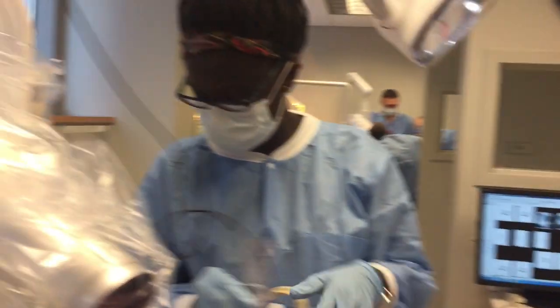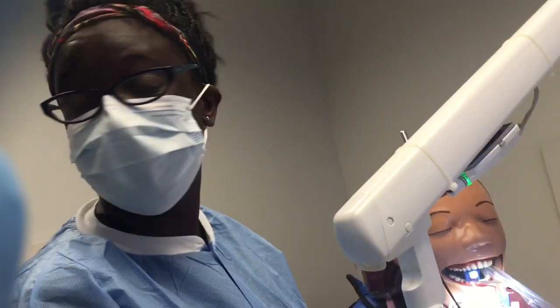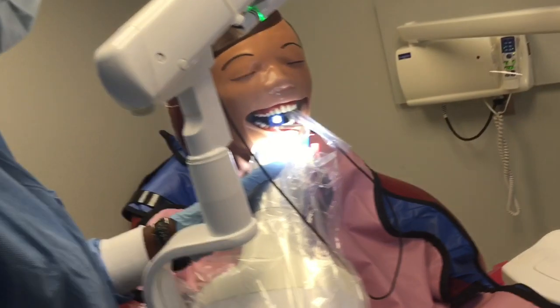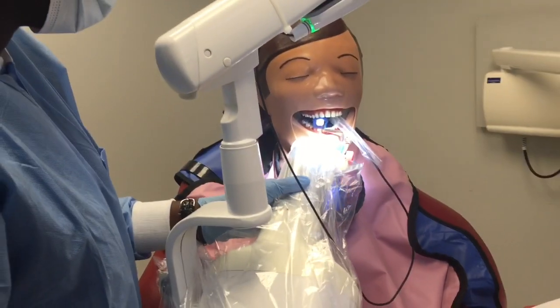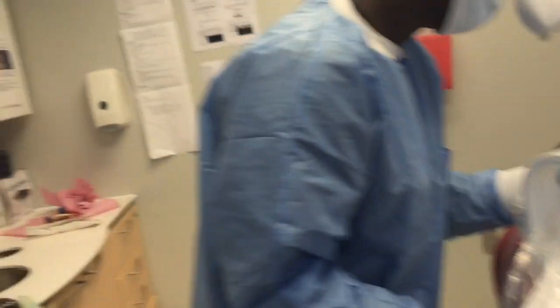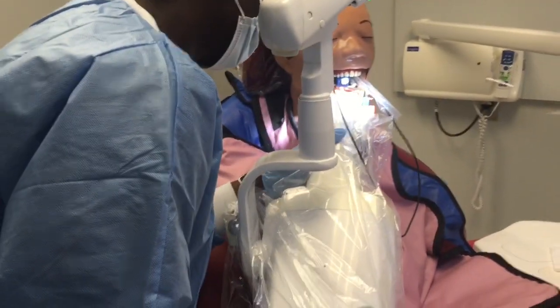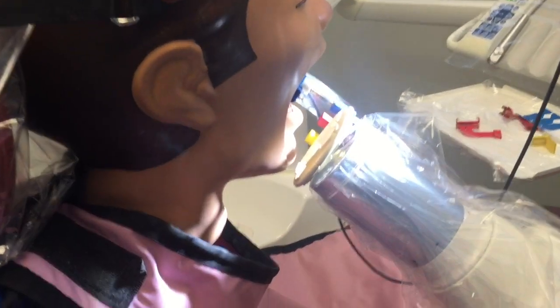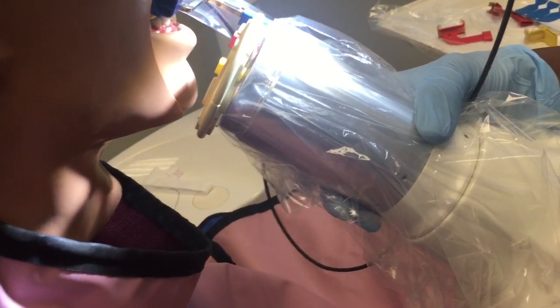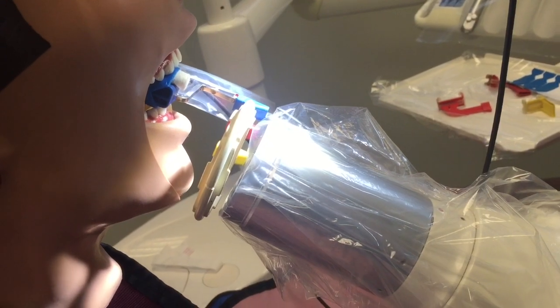We're going to take a radiograph of Dexter today, which is what I'm trying to figure out for the anterior. I got some help from a professor and so we're ready to take a radiograph of Dexter. Does this look right? There's too much space in between — can you see? Maybe this is the best it can do.